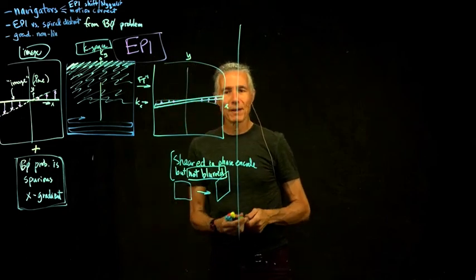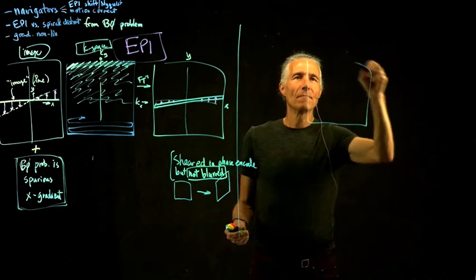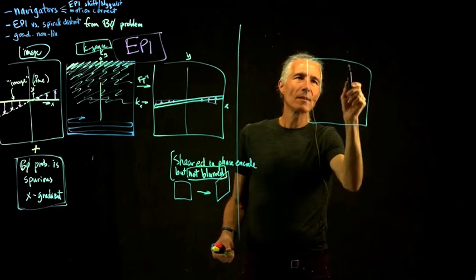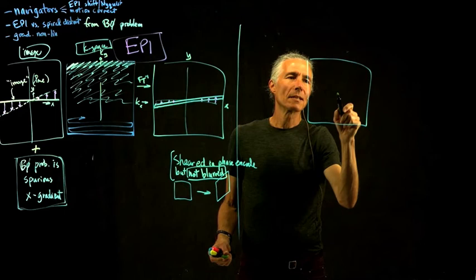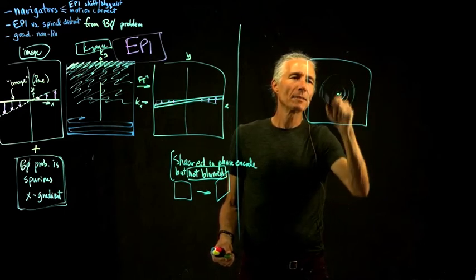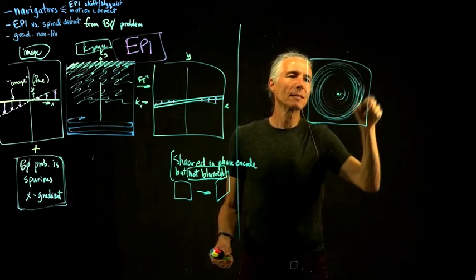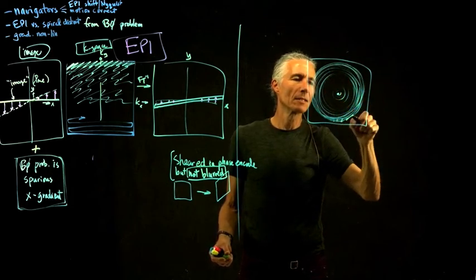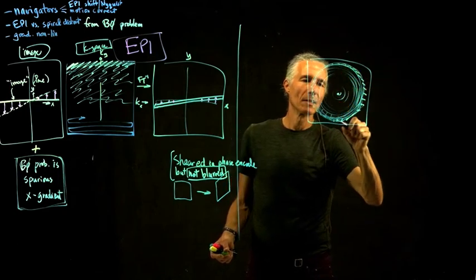So what happens with a spiral? If you look at a spiral, here's the k-space of a spiral. Say we start from the middle and go around like that. What happens is the error starts to build up, and so higher spatial frequencies have more error, or vice versa. If we started from higher spatial frequencies, then lower spatial frequencies would have more error.